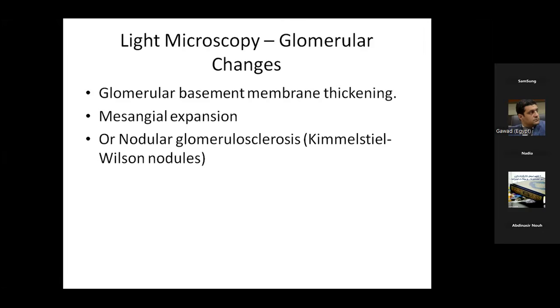Many cases are the cause that we see this lesion under light microscope, but it's not the first indication for a patient with microalbuminuria who is a known diabetic to be a candidate for a renal biopsy. But we frequently see it in different scenarios.